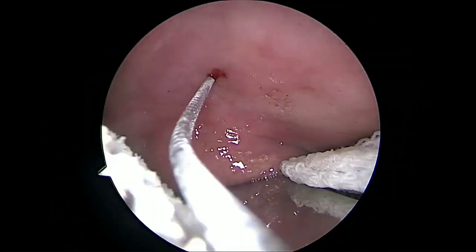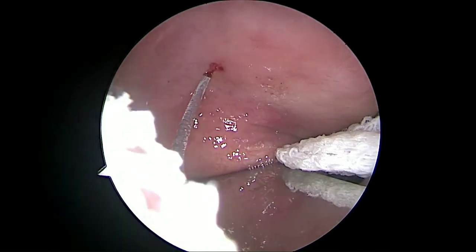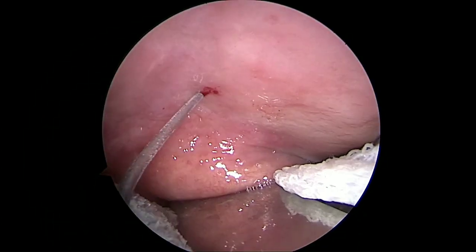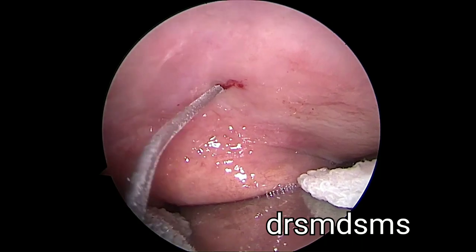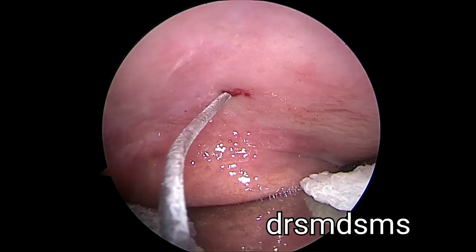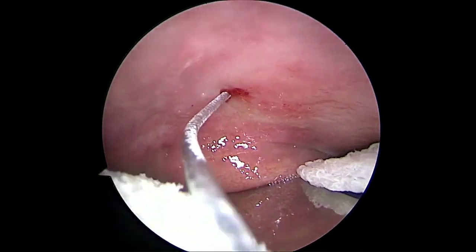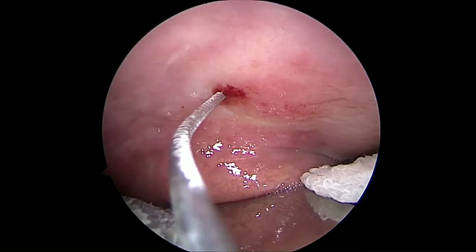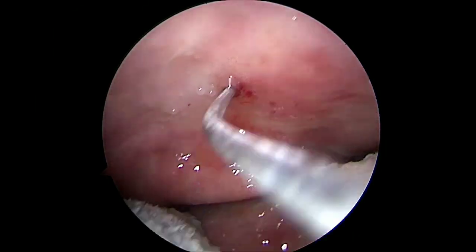You have to bend the needle at 25 mm from the tip at about a 45-degree angle, so you can insert the needle into the spot. There you can give the infiltration.